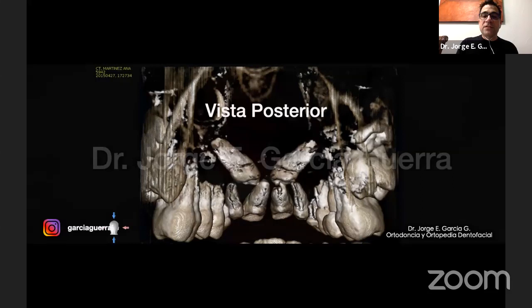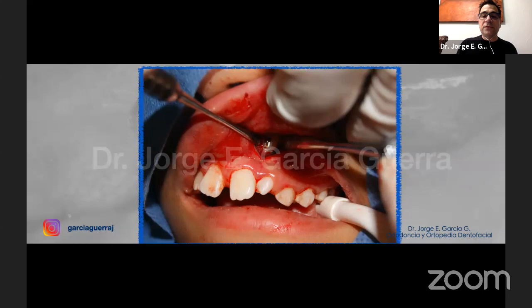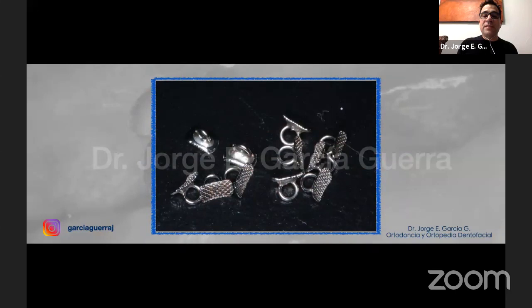So this is an eyelet that we put on the canine. This was done by a perio doctor. And this is the eyelet. Now, the reason why we're using this is so we can pass the chain through the eyelet, and you can hold it easier than with the button, because with a normal button, it's easier for them to loosen off. So this is 2x12 mini implants that we're gonna position.